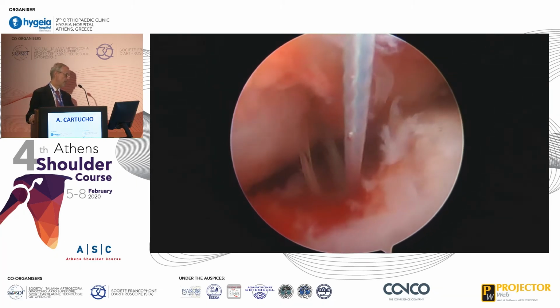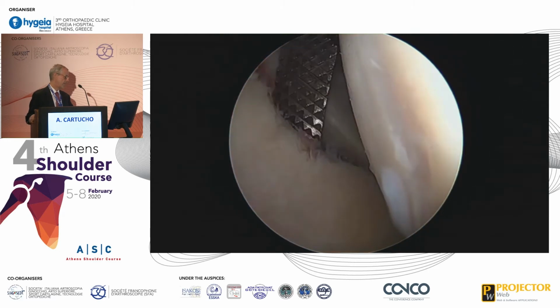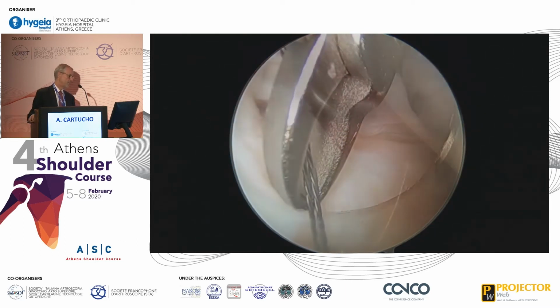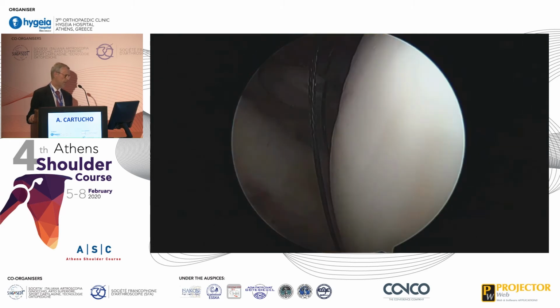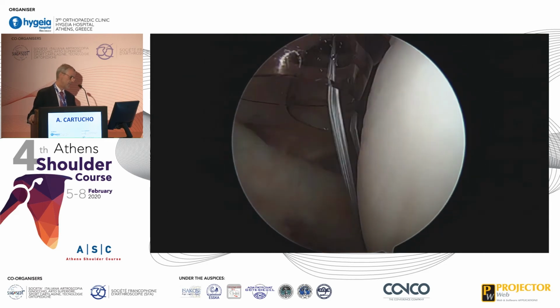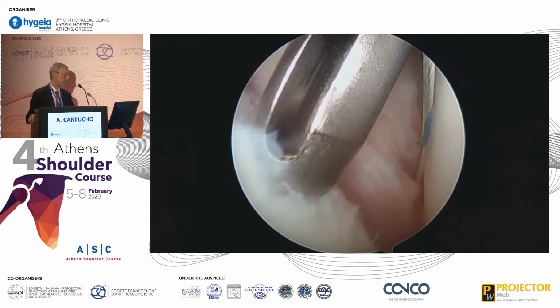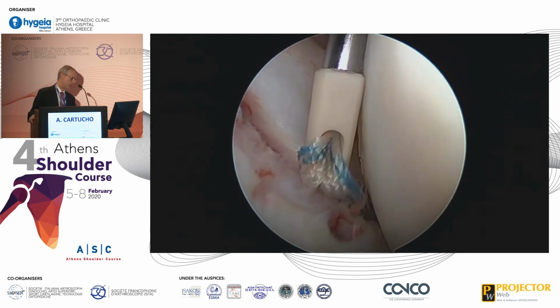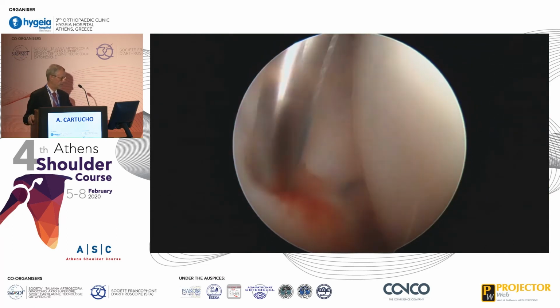So I repeat, and I want to have this kind of aspect at the end of my preparation of the remplissage. Then I go again to the front, and here I don't need to be in the anterior portal again, and I do my Bankart procedure. So I prepare my remplissage before my Bankart, and then I do my Bankart here with knotless anchors and using tapes instead of strings in order to get more contact with my bone, and it has been published before. Perhaps it's less painful when we use tapes instead of strands. Then this is a common procedure for a Bankart.